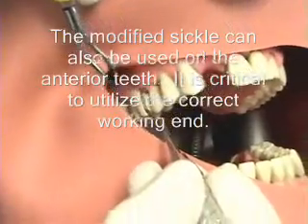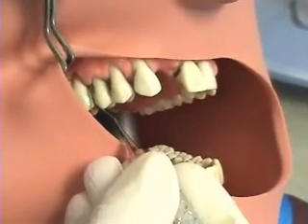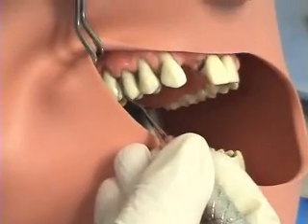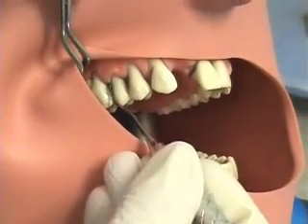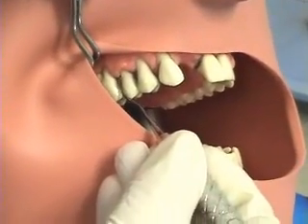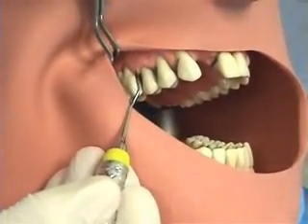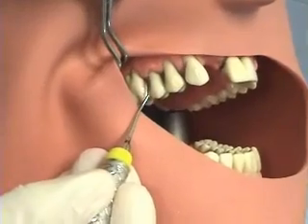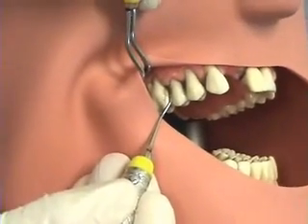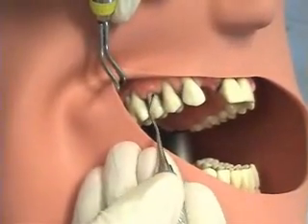The modified sickle is used in the posterior from the distal line angle into the distal, and then from the distal line angle into the mesial. To find the correct working end, place the instrument parallel to the long axis of the tooth. The terminal shank is parallel, the handle should point out of the mouth, and the very last bump or curve of the instrument will point towards the tonsil — this is the correct working end for the maxillary right buccal teeth. If you had the incorrect working end, the handle would point towards the back of the mouth and that last bump would point towards the front, which is not correct and would actually be impossible to use further posteriorly.